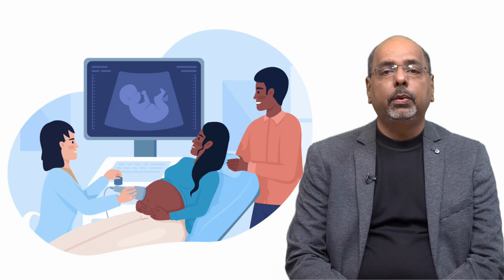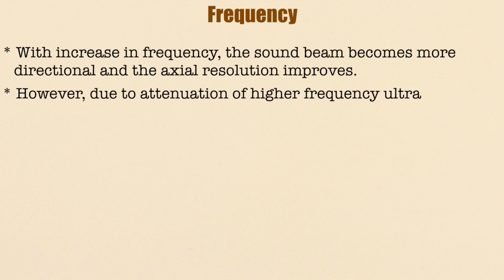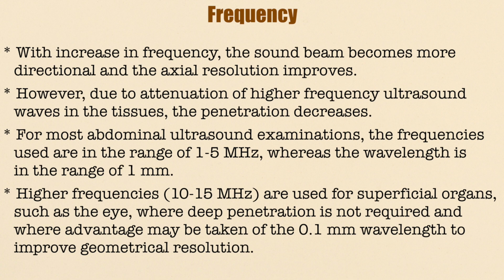We are going to see the effect of frequency on the performance of ultrasound imaging. With increase in frequency, the sound beam becomes more directional and the axial resolution improves. However, due to attenuation of higher frequency ultrasound waves in the tissues, the penetration decreases.